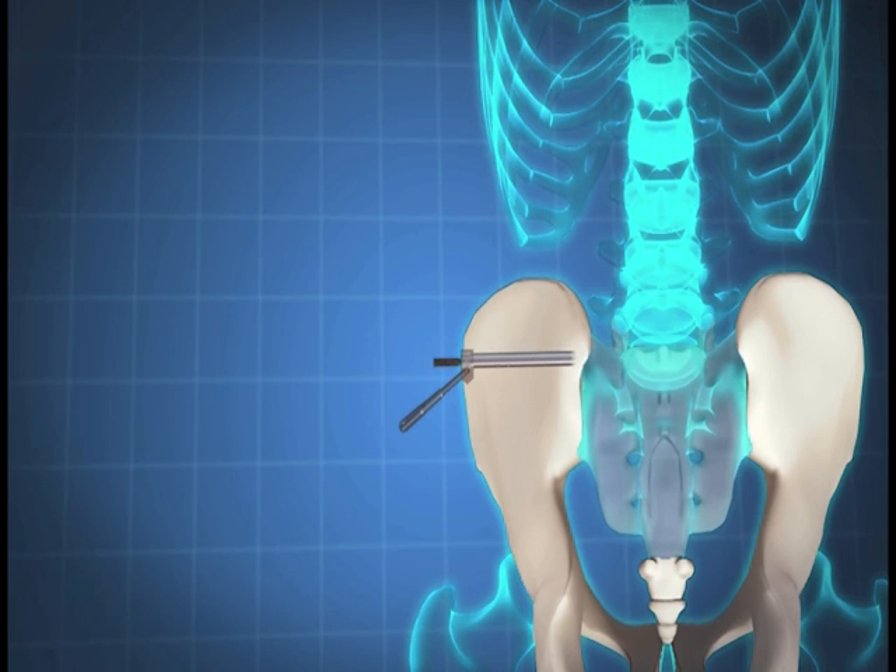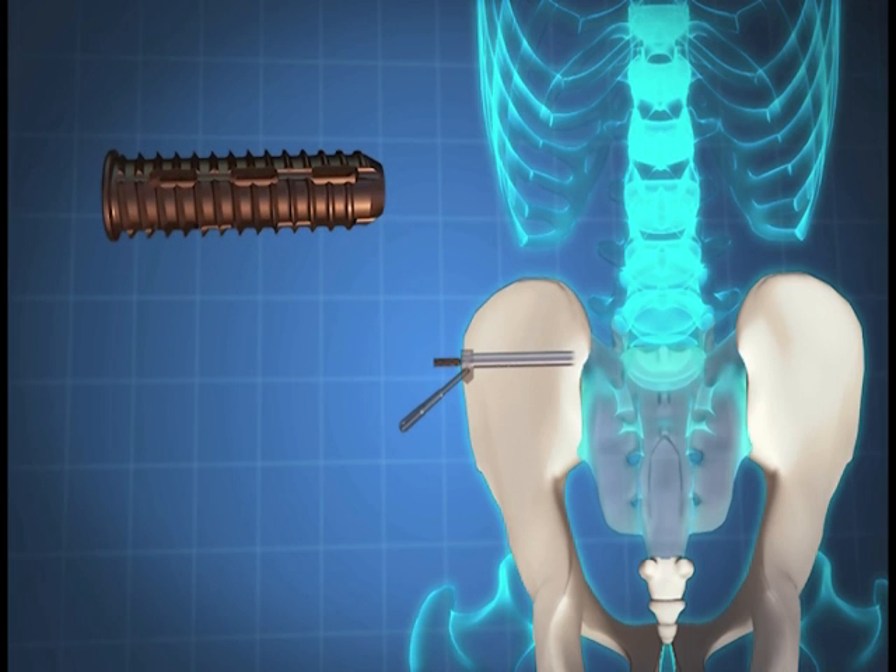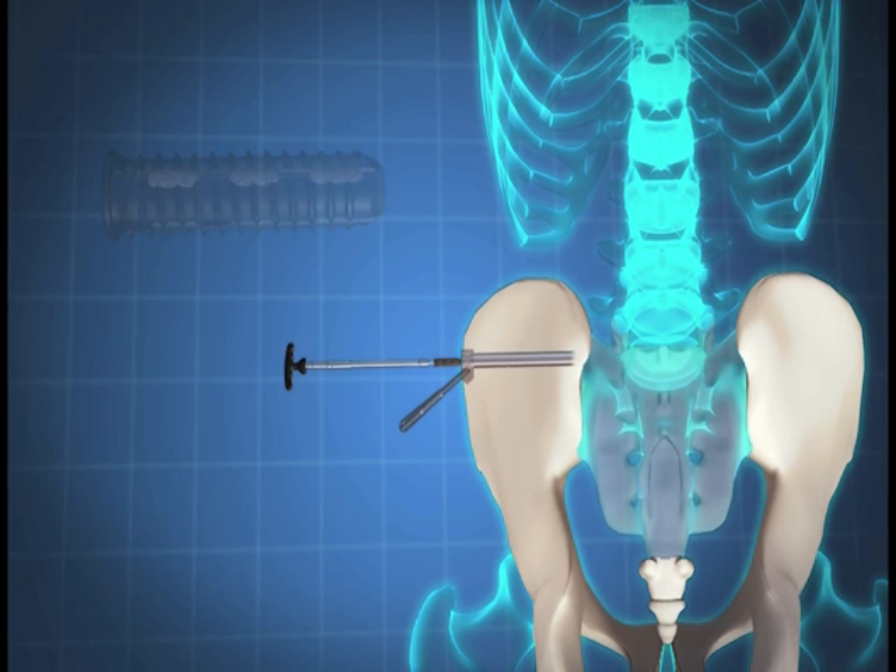Fill the Samba screw with demineralized allograft bone prior to insertion. Install the cannulated Torx driver bit into the Torx bit T-handle. Insert the assembled Torx driver bit into the drill guide and advance the Samba screw into the pilot hole until the screw head stops against the ilium. Remove the cannulated Torx driver bit.